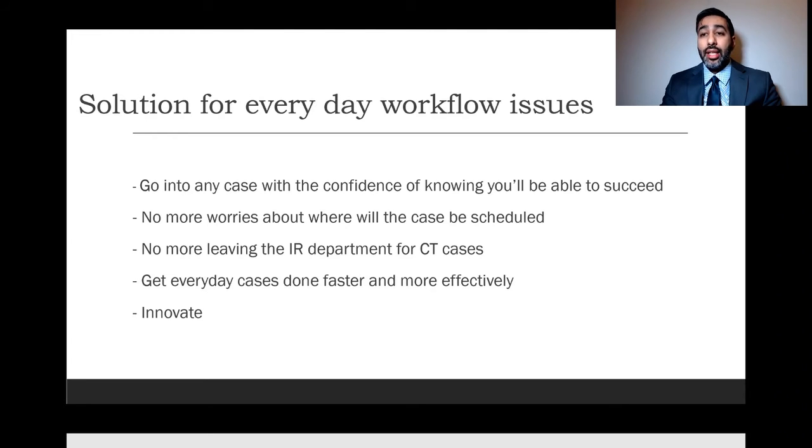Or for example, when I had a kyphoplasty just a week or two ago, severely osteopenic patient, multiple previous kyphoplasties, T2 acute compression fracture, bring him in with anesthesia, do angiographically or fluoroscopically, can't make out the pedicles at all. So osteopenic, switch over to CT, get my access, switch right back over to angio, get the cement in without any issues.